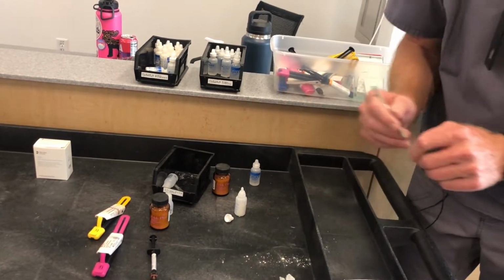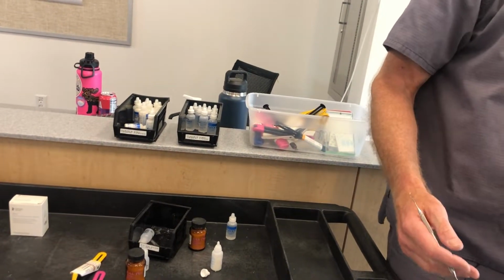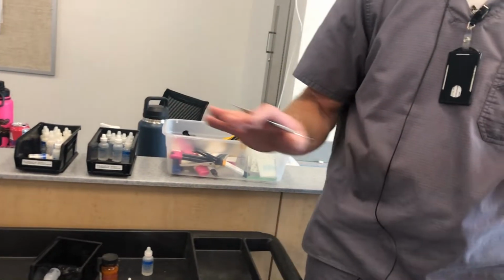So, there's a couple of things in dentistry that the date on them truly means the date on them. One is anesthetic. A month or two after its expiration date, you're shooting blanks, literally. It typically will not work. And then cements, resins can be that way. Cements, bisacryls can be that way. The biggest problem with a bisacryl going beyond its shelf life is not so much that it won't set, but it gets discolored. They darken. They don't look very good, so you gotta be careful that way. But these cements, you definitely wanna use them within their shelf life. Just make sure your assistants put the lid back on right after. Oh, yes. You don't want them sitting out.